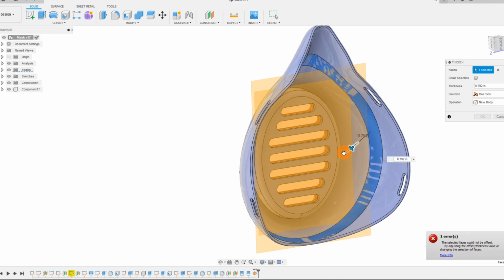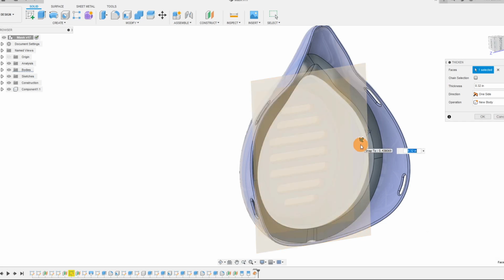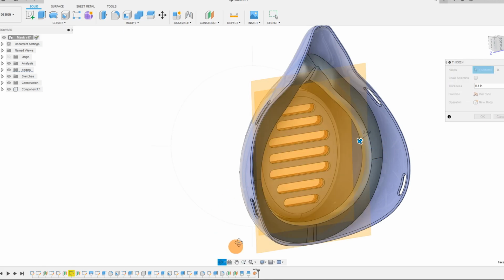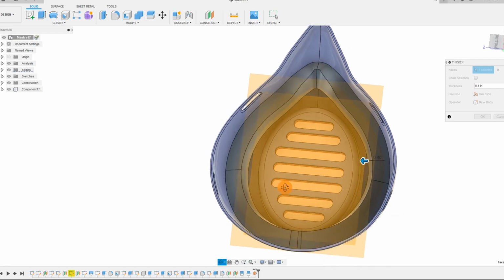and I'm just going to drag it in. And if you drag it in by too much, you're definitely going to get an error. It's really not a surprise. But if you drag it just enough, you'll find that it's possible to create it as long as it isn't too thick. So we're going to play around a little bit with how thick we want it to be. I could try 0.4 to see if there are any issues. And so you can see that the gasket has appeared here.